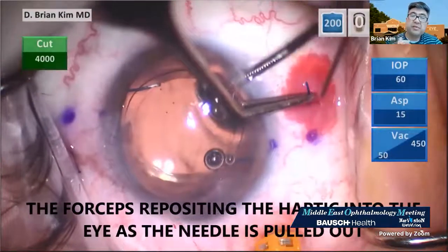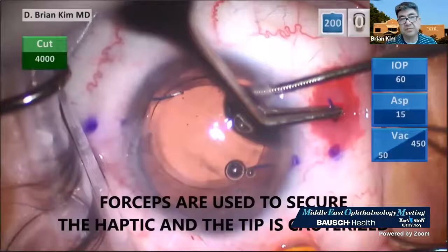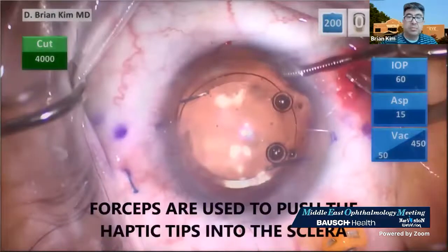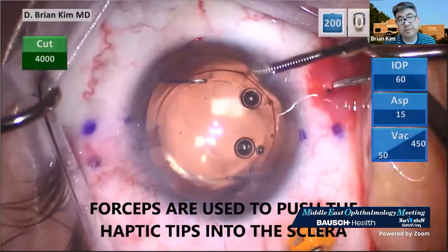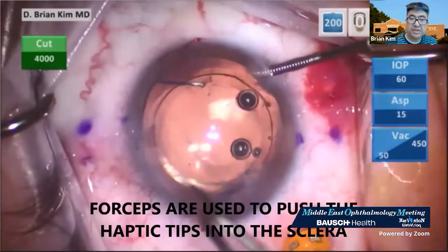You want to prevent externalizing the haptic too much on the left side, because if you pull too much of the haptic out, that means you're actually potentially pulling the right side haptic out of the needle, potentially. And then you push the haptic tips into the sclera.